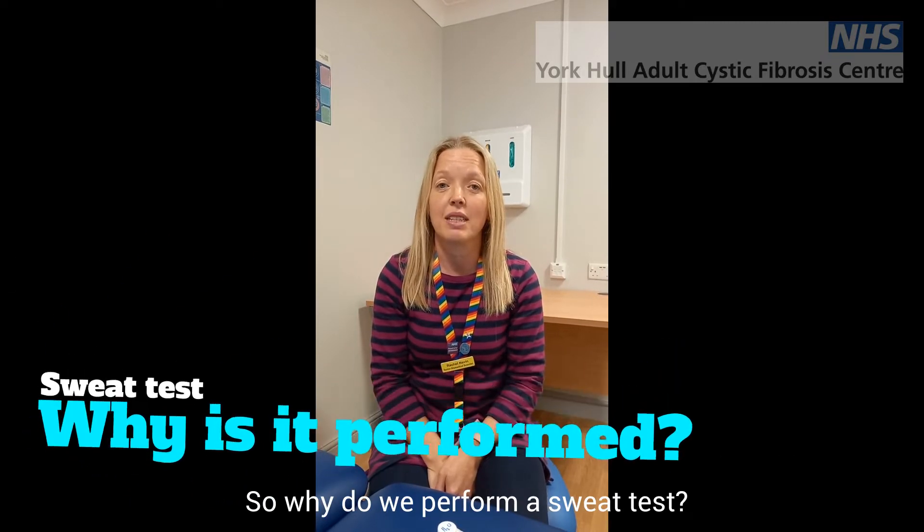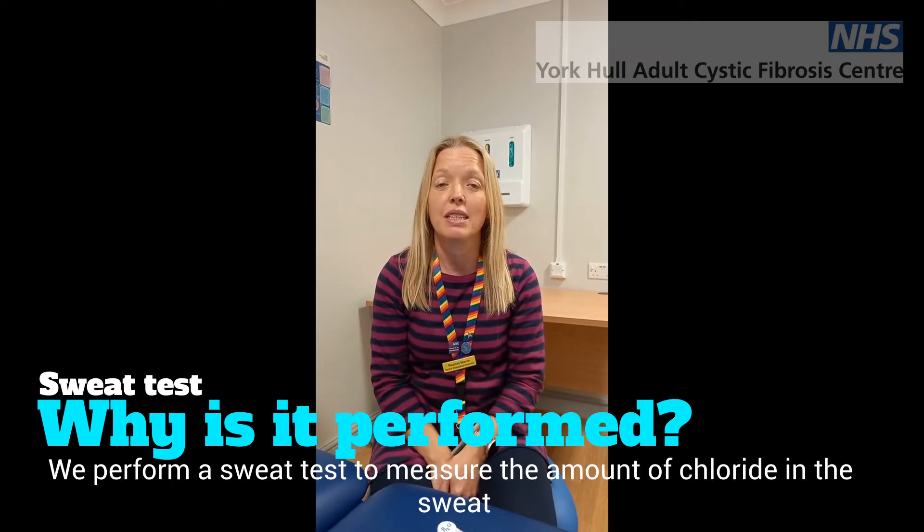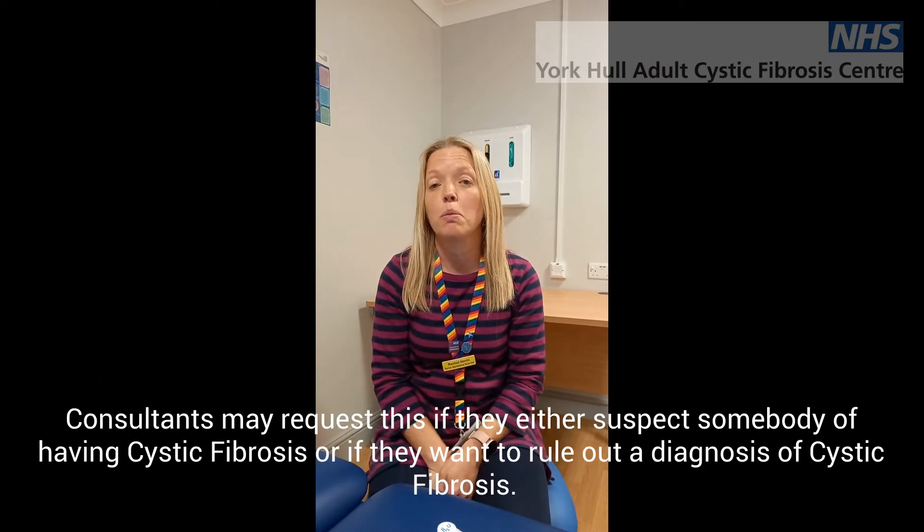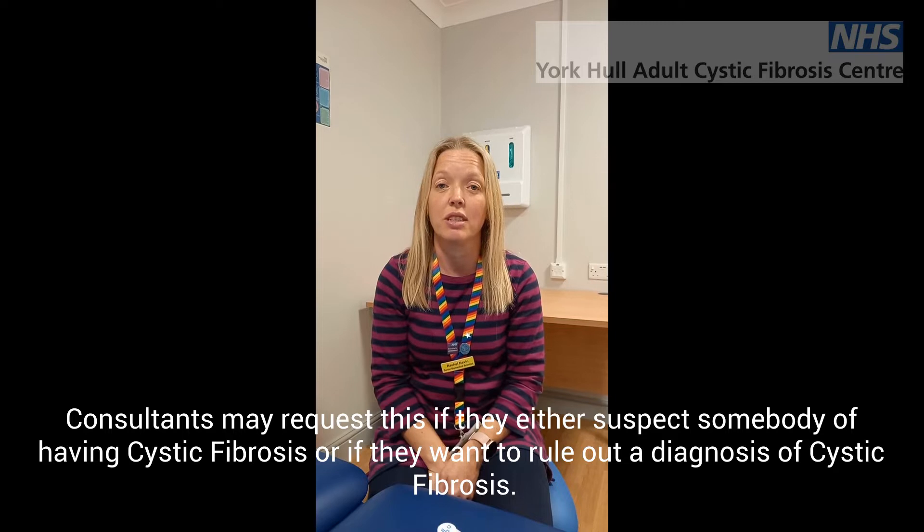So why do we perform sweat tests? We perform a sweat test to measure the amount of chloride in the sweat. The consultant may request this if they either suspect somebody of having cystic fibrosis, or if they want to rule out a diagnosis of cystic fibrosis.